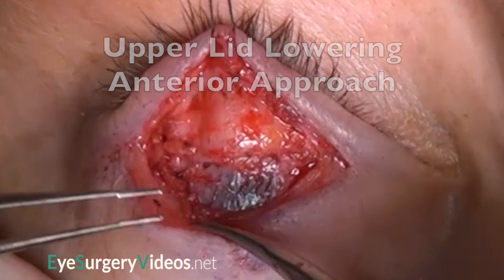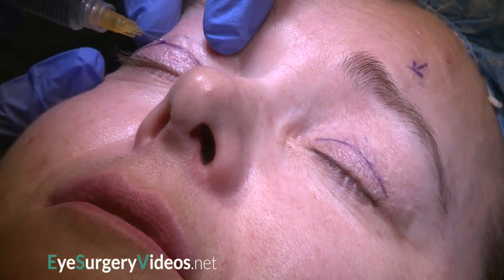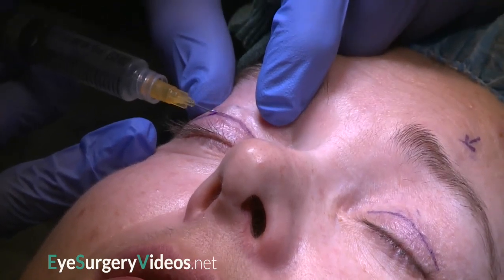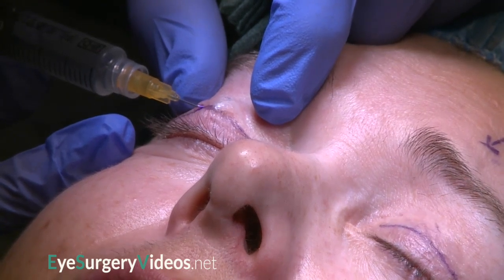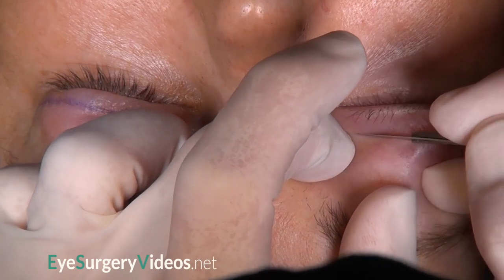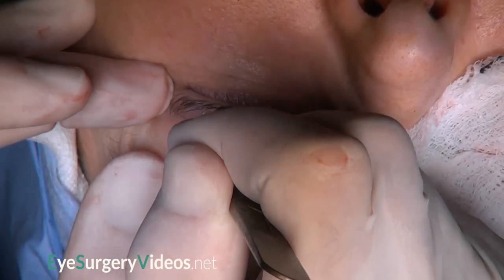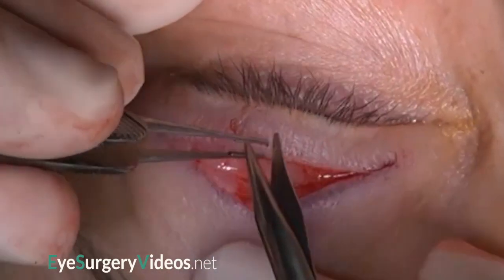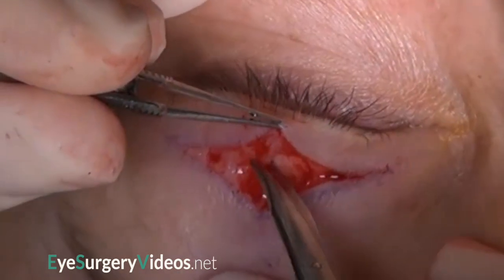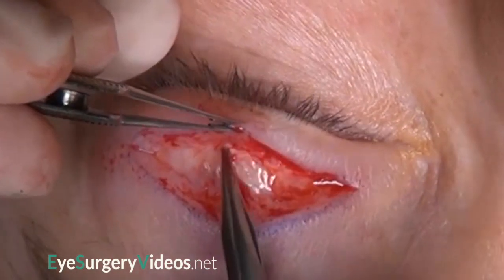This patient with thyroid eye disease has pronounced upper lid retraction. The upper lid's skin creases have been marked, and subcutaneous local anaesthetic with adrenaline is injected. The skin and orbicularis are incised with a number 15 blade. Dissection through orbicularis onto the tarsal plate is seen on the fellow eye. The tarsal plate is exposed, and a superior third of the tarsal plate is cleared across its full width.